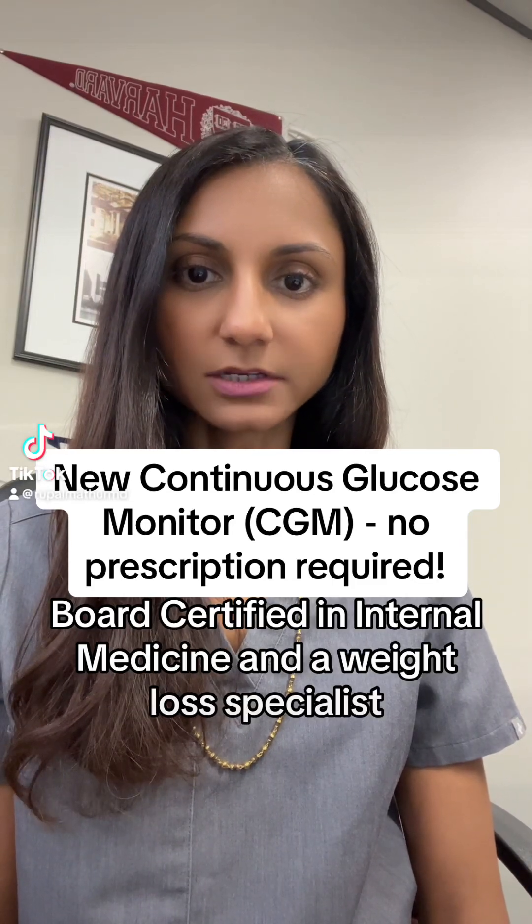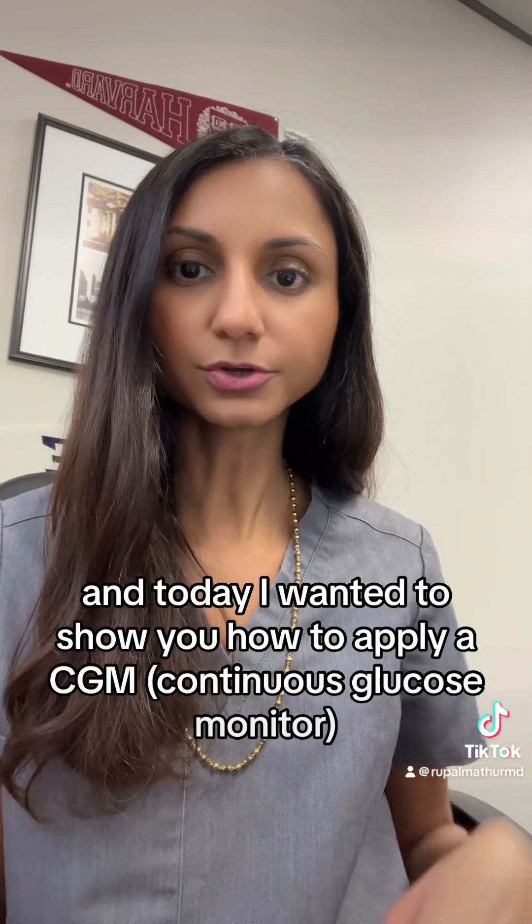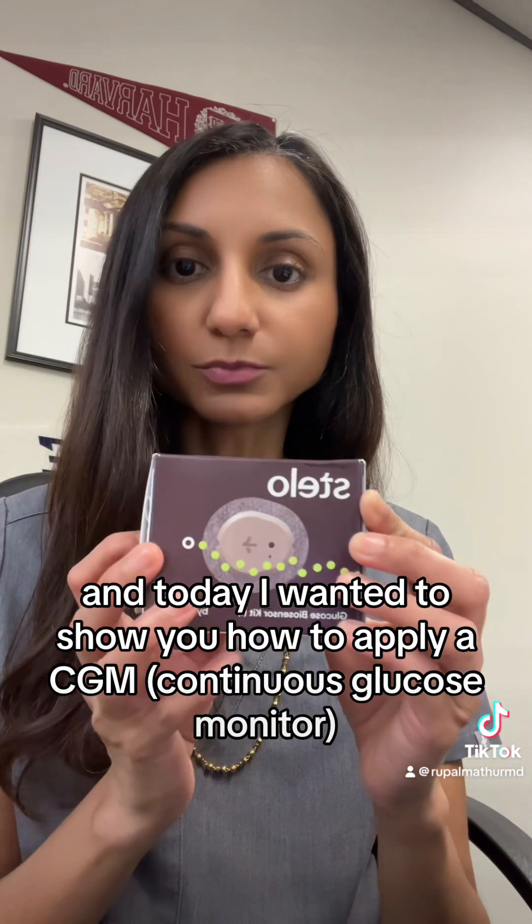Dr. Rupal Mather here, board-certified internal medicine and weight loss specialist. Today I wanted to show you how to apply a CGM, a continuous glucose monitor.